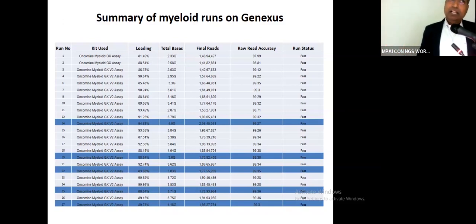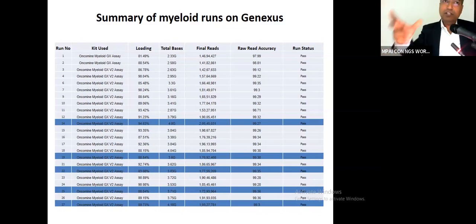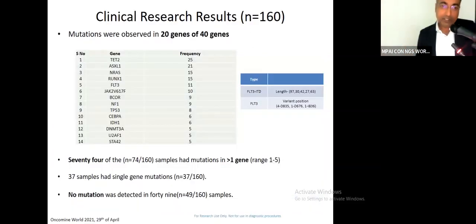But we do QC of the extracted DNA. Subsequently, everything the sequencer does. There is a failure rate. Of course, there are problems. The sample fails in around 10 to 15% of the cases. And this is because of the way of giving a spin, the way of keeping your cartridges, or the reagents. Some of these are issues which need to be sorted.